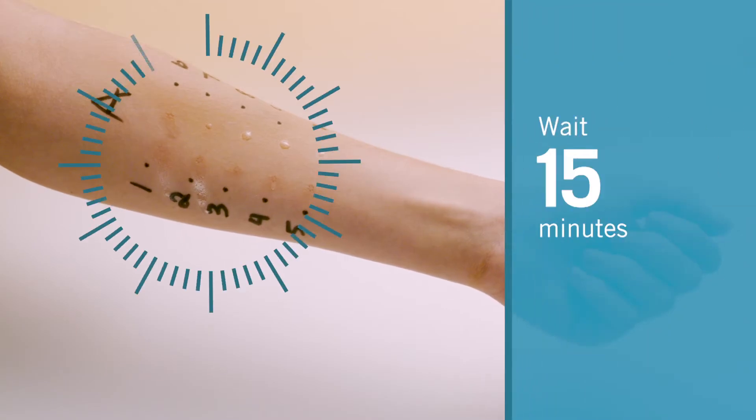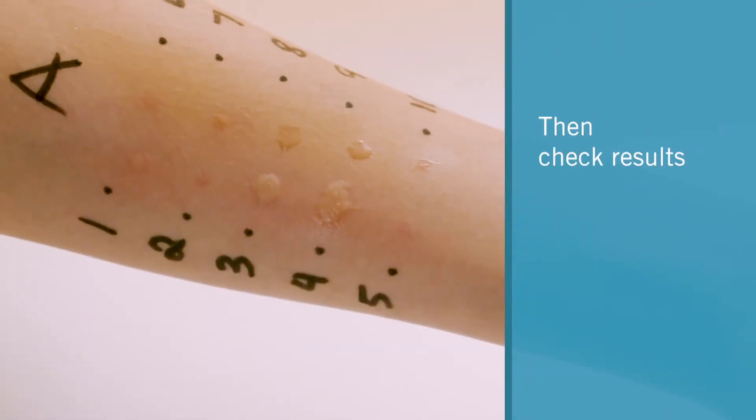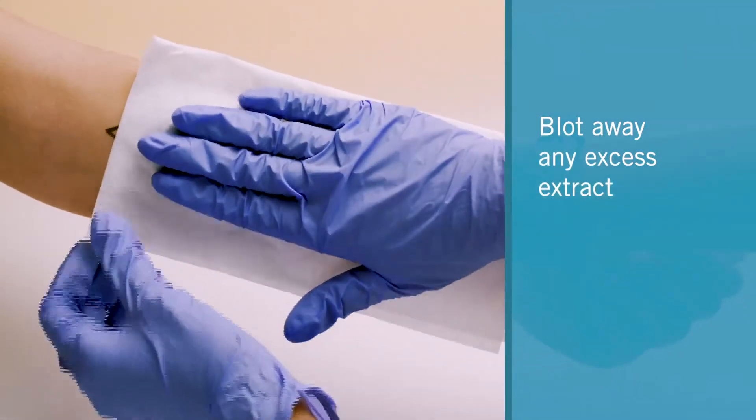Wait 15 minutes, then check results. Blot away any excess extract.